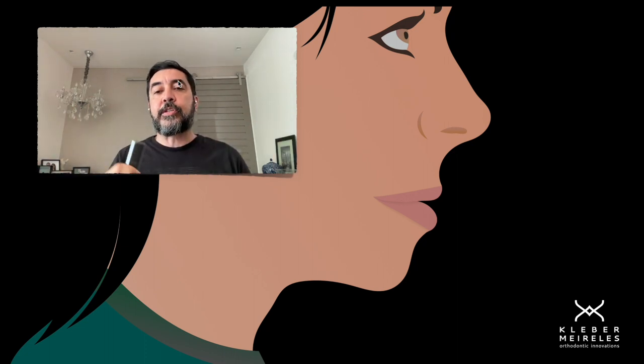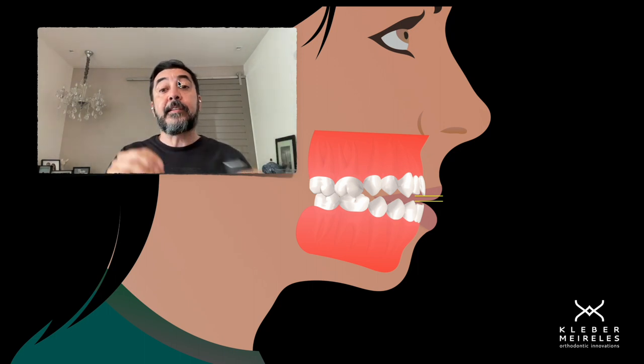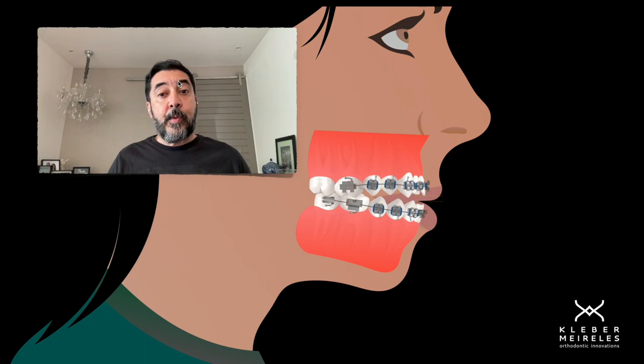In those kinds of situations, we need to have this kind of anterior open bite in which we don't have exposure of anterior teeth in the rest lip position. In this case here, as you can see, we don't have it.